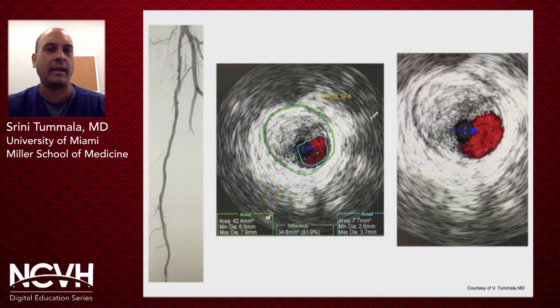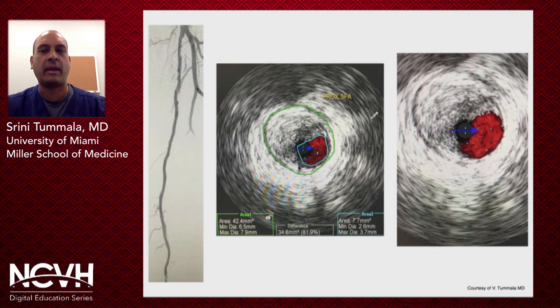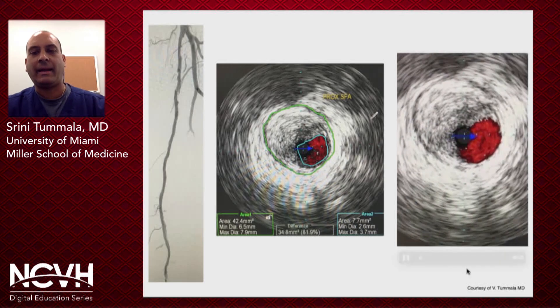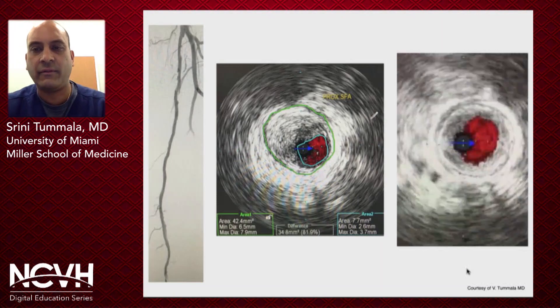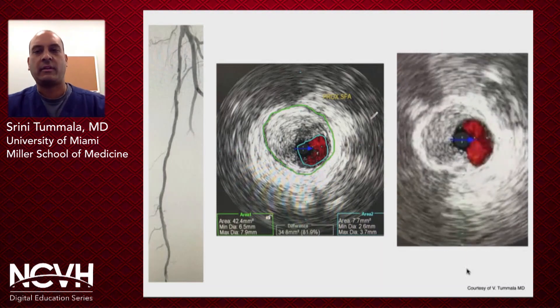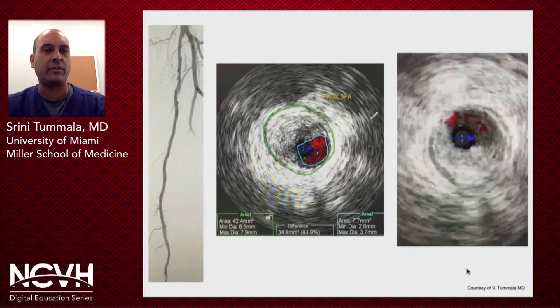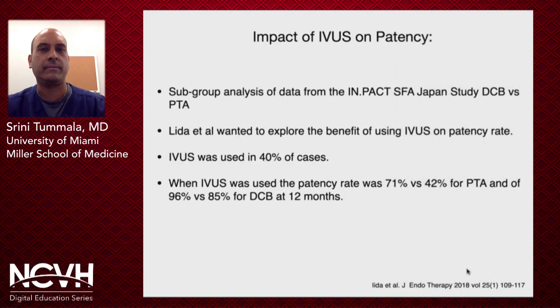Here's another example. The angiogram shows some level of atherosclerotic plaque through this segment, but when you look with IVUS, you can see there's almost 82 percent luminal compromise or stenosis with significant atherosclerotic plaque. On real time the IVUS video shows very complex morphology and plaque composition. This clearly requires some level of intervention — whereas angiography might suggest just an angioplasty, this may actually need something like a scaffold to fix it.